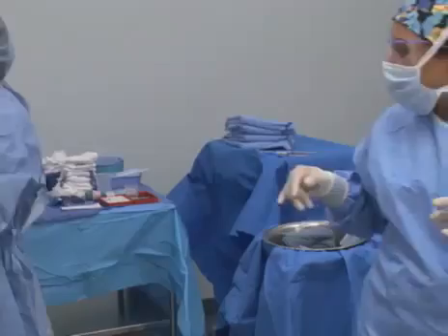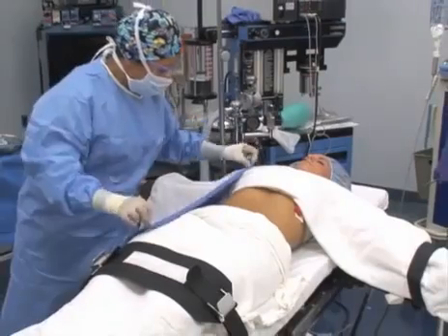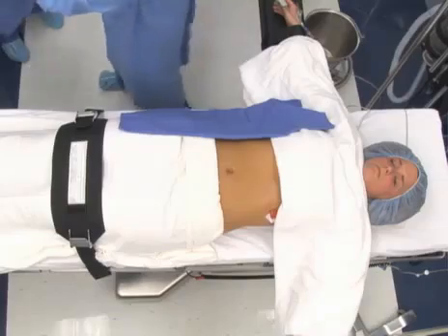The procedure for draping the abdomen is one of the most common draping techniques and may be used for many surgical procedures regarding the abdominal cavity. Surgical towels made of heavy absorbent cloth are used to make a frame around the incision site. Towels are folded along one edge before positioning them on the patient.